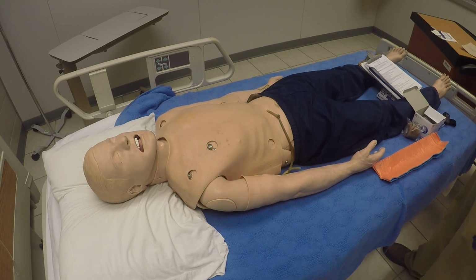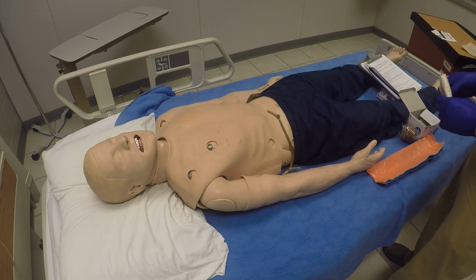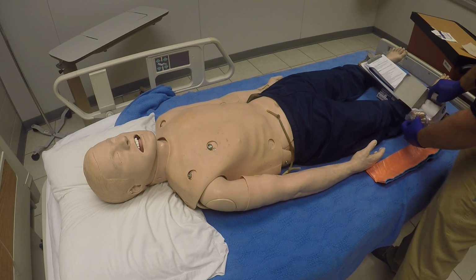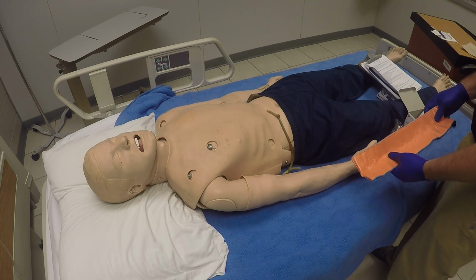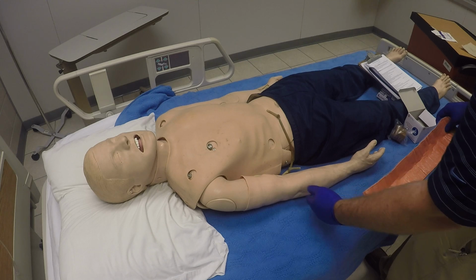Okay, this is joint splinting. First thing we want to do is make sure we have all of our equipment. We have our cravat here, or better known as triangle bandage, in case you need that. We do have some roller gauze and some padding material here, some Coban, and then we have our splinting material as well. We're going to go ahead and immobilize the elbow area.